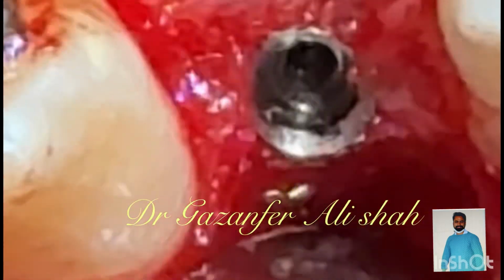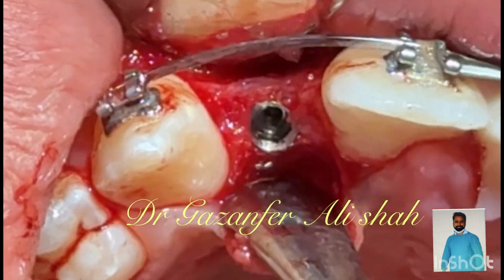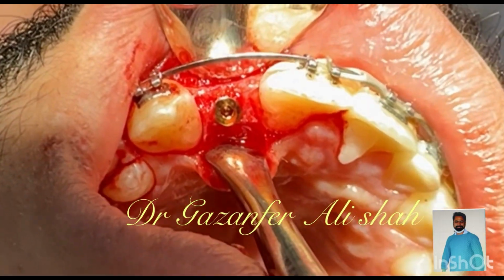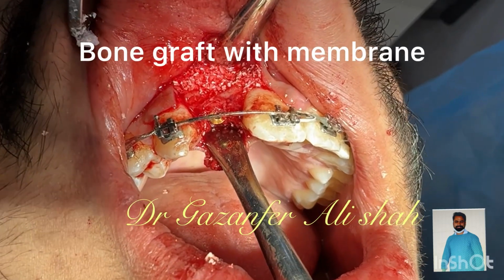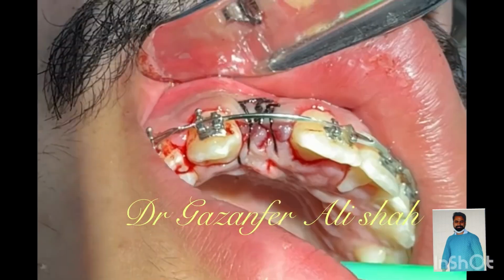You can check the occlusal view of the implant fixture. In this case, we have a deficit in buccal contouring at the apical area. We are augmenting this area with bone graft overlaid with a membrane. After that, we are suturing the flap.